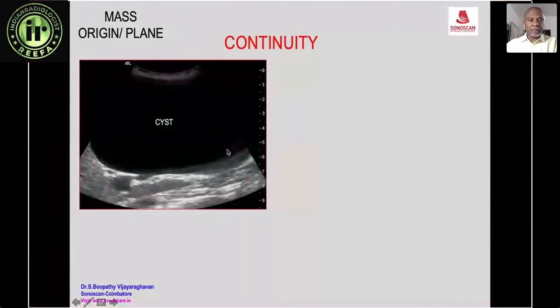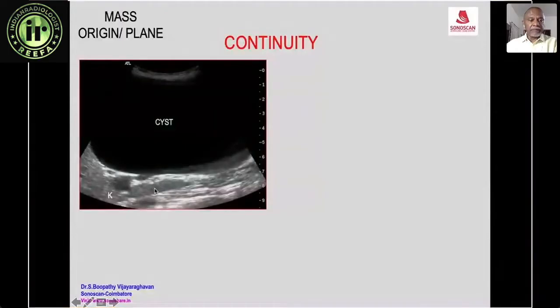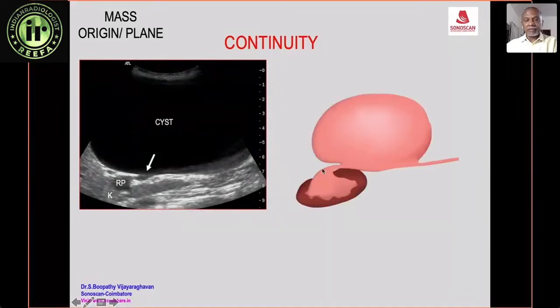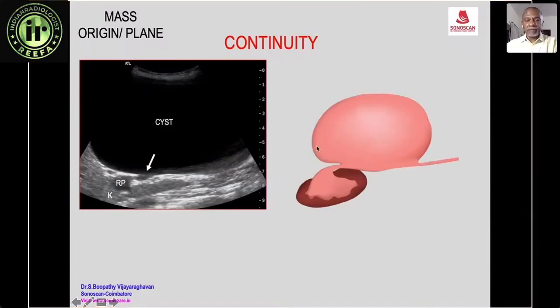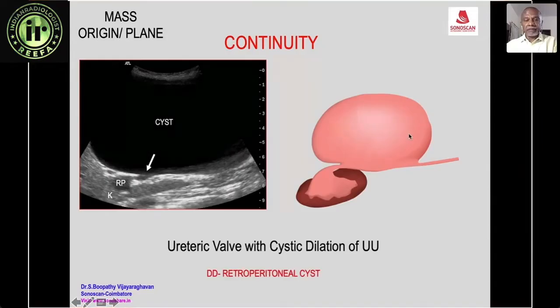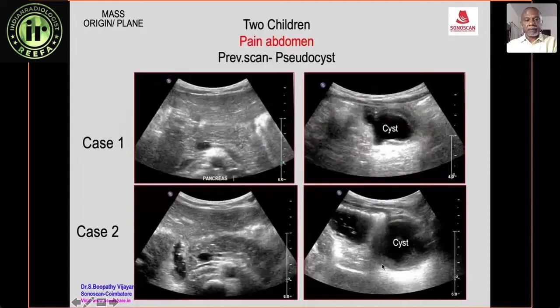A large cyst is seen in the right flank with the kidney and a mildly dilated renal pelvis. There is communication between the renal pelvis and the large cyst. Further imaging shows grossly dilated calyces and pelvis communicating with a hugely dilated upper ureter — consistent with a ureteric valve causing cystic dilatation of the upper ureter. The differential diagnosis is a retroperitoneal cyst.